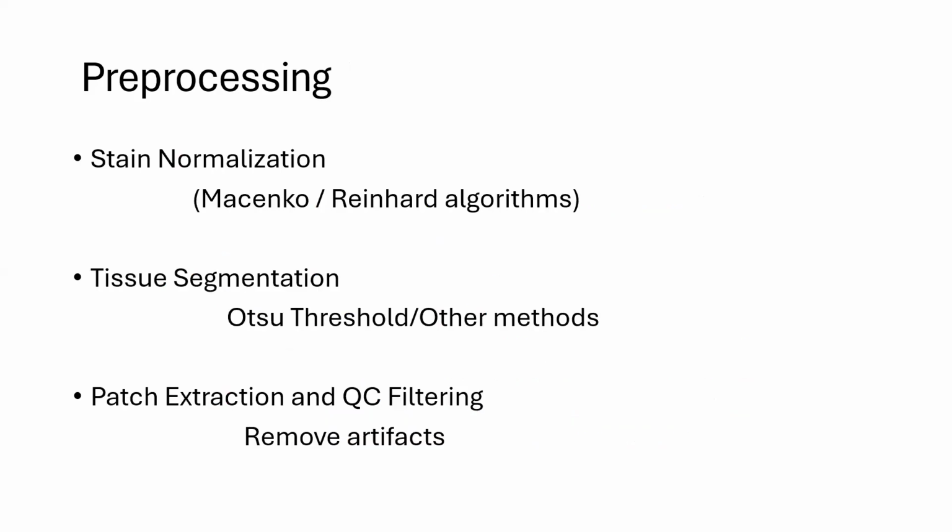And as we know, we need to do some pre-processing. For every model and every dataset, we need some pre-processing.